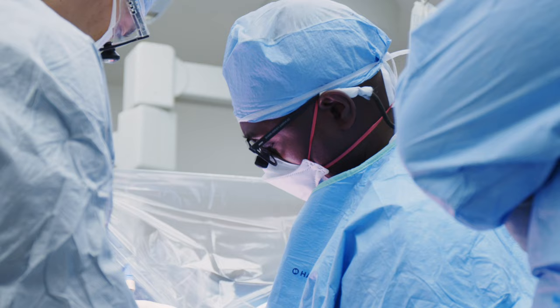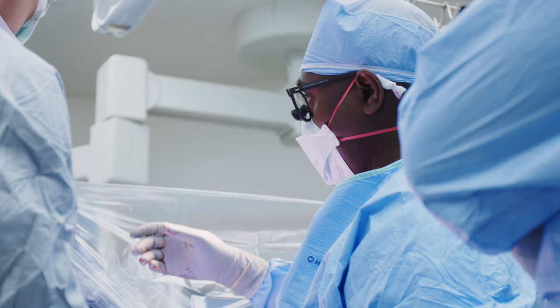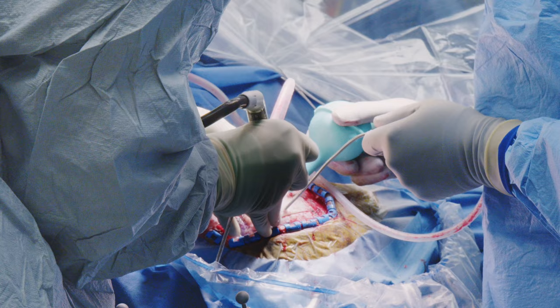We're gonna drill — I just want to make sure she's not startled. You're gonna hear a loud noise, sweetie. Okay, sounds good. A loud noise, your teeth may chatter.